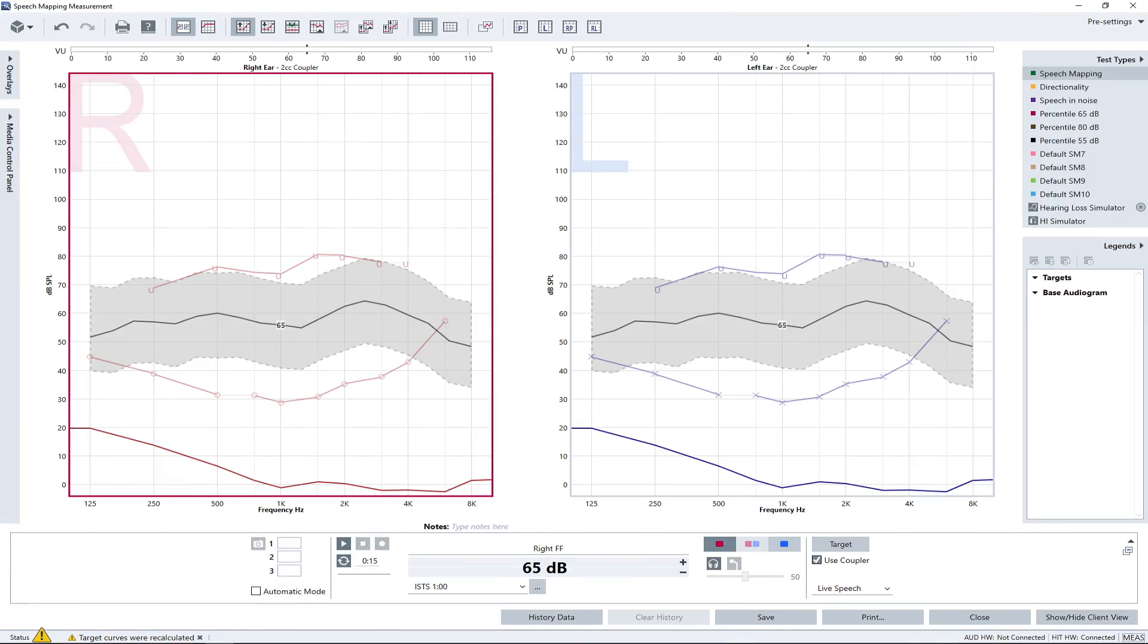Prior to the measurement, have the hearing aid programmed with first fit settings and make sure that the omnidirectional microphone setting is activated.